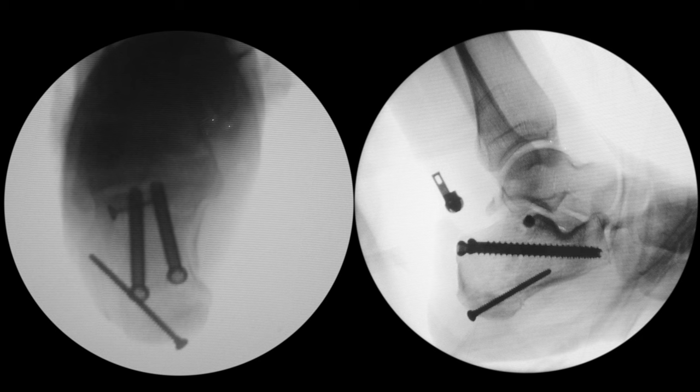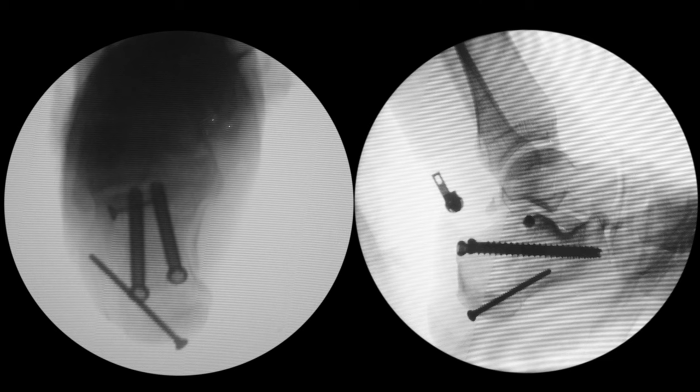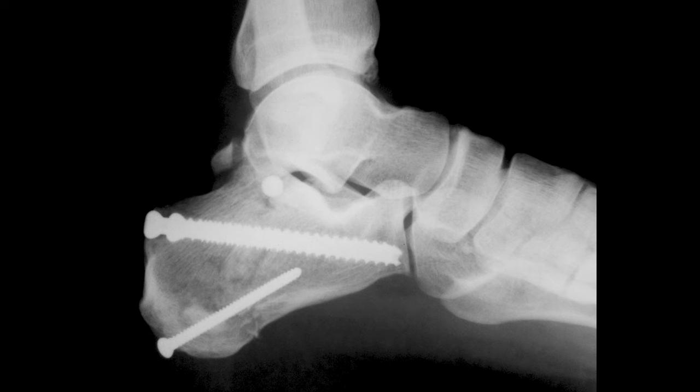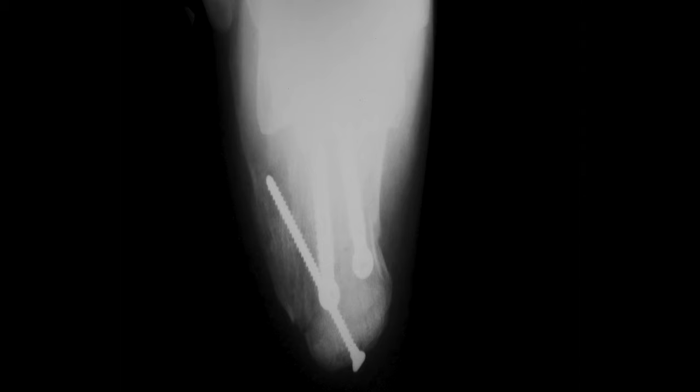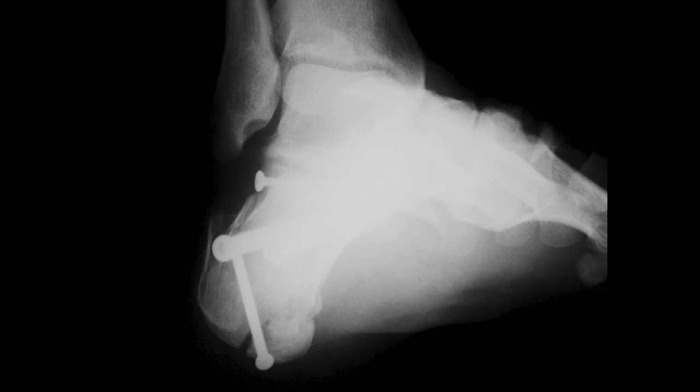The installation was not perfect, as you can see on the picture, and we considered early removal of this screw due to its prominence. This is the final X-ray. After two months, the patient started walking with full weight bearing. He refused to visit our hospital for follow-up, but we could contact him by phone. At the fourth month after surgery, he returned to work.